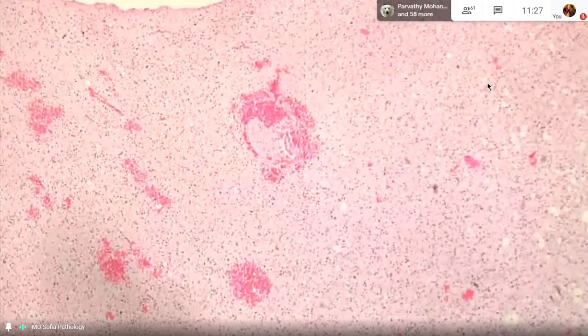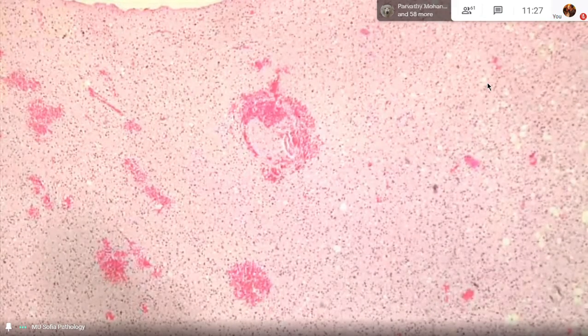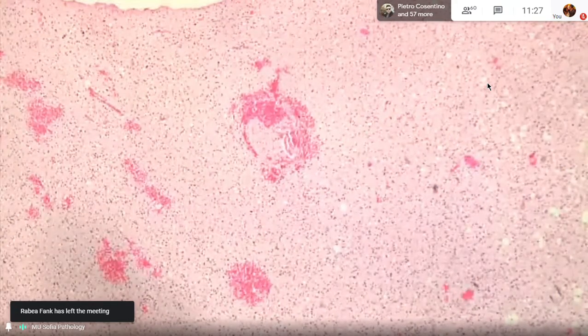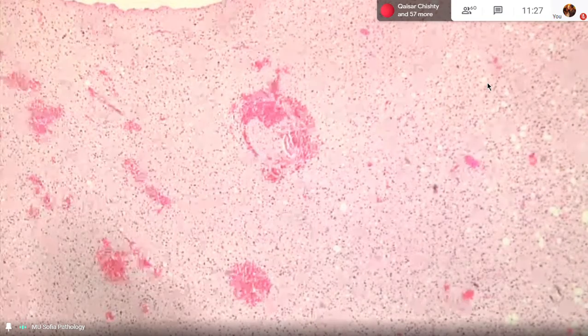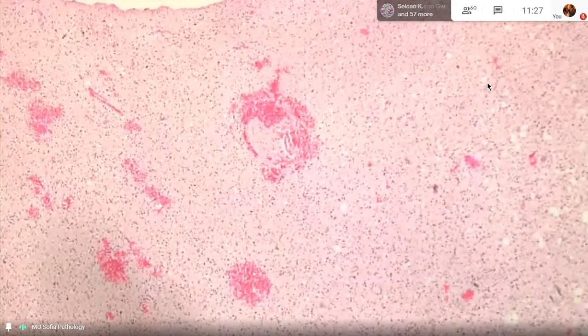And from the tumors that we have for today to demonstrate, we'll have the meningioma and neurinoma, which are, from a morphology point of view, without atypia, no aggressiveness. They are well circumscribed or encapsulated. They grow, they compress the surrounding structures. So location is the most important thing for the prognosis of the patient.